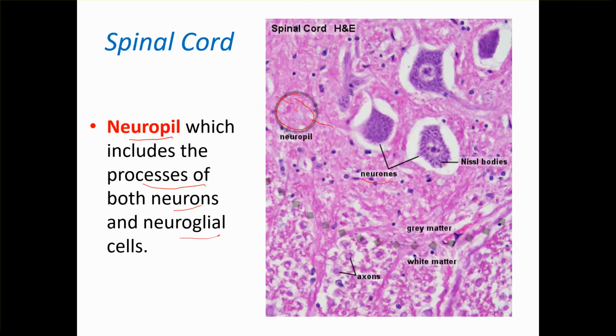The nucleus of the neurons, and you can see the dark staining by the Nissl bodies. Nissl bodies are present within the cell. Then this is also the gray matter area, and this is the white matter. So the previous slide, in which we saw the H and the area around the H, which is the white matter, this is a higher focus just to see the structures more clearly.